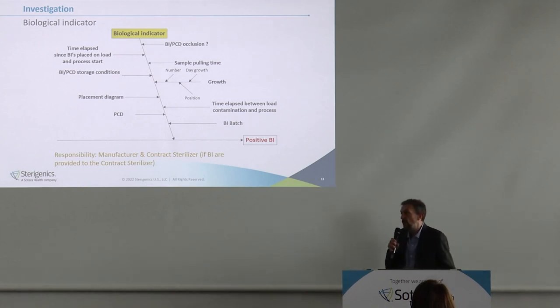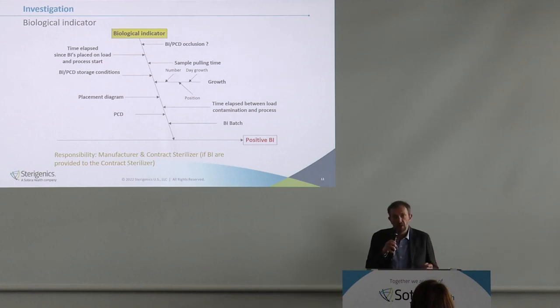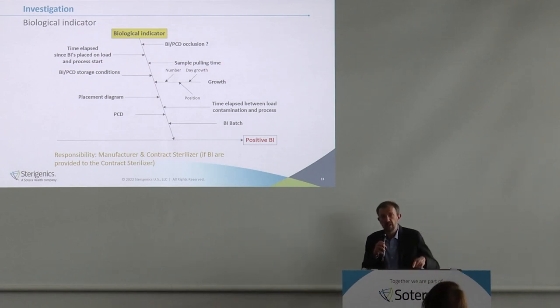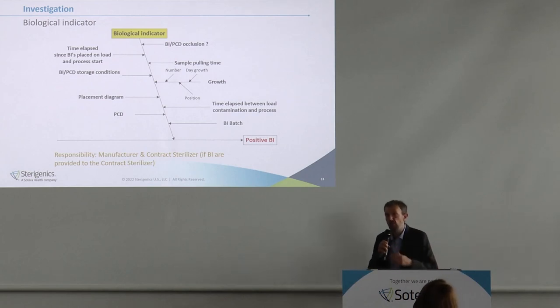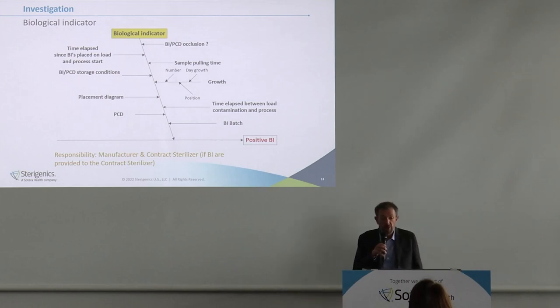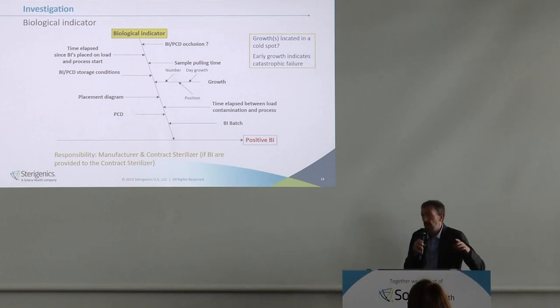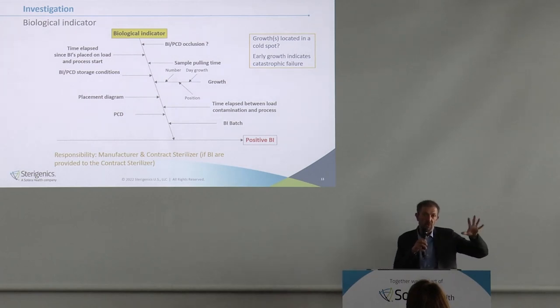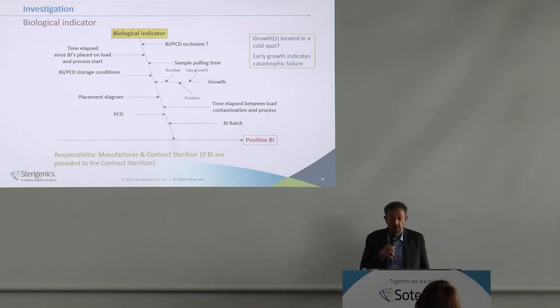Within our network at Sterigenics and Nelson Labs we have a centralized database to track all batches giving unexpected results, so we can identify if it's the same BI batch causing issues, then isolate, quarantine, and remove that batch from use. Manufacturing conditions may vary, and we need traceability of which position showed growth so we can trace it back to the pallet location and the conditions around that pallet.